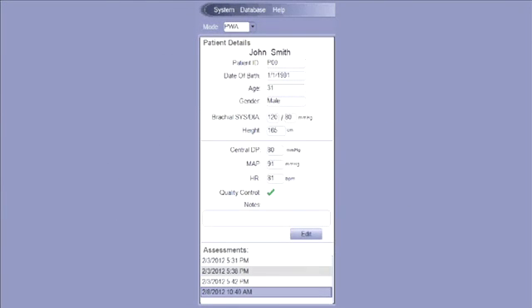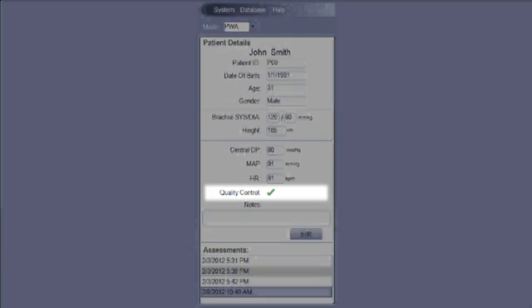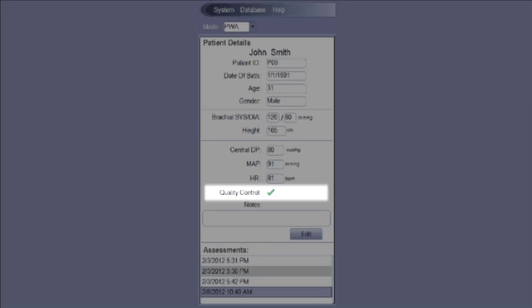Always review the quality control section of the report. If the measurement is of acceptable quality, a green check mark will be displayed. If a red cross is displayed, repeat the measurement.